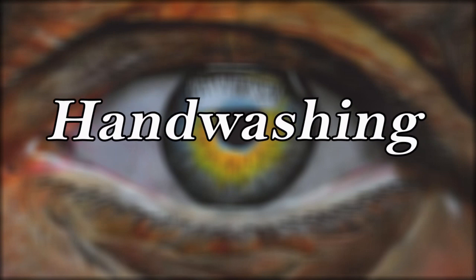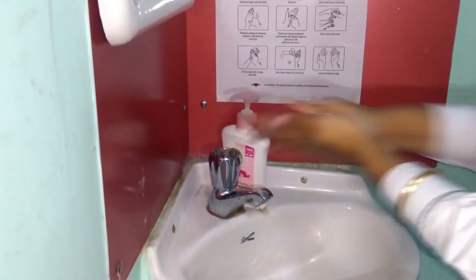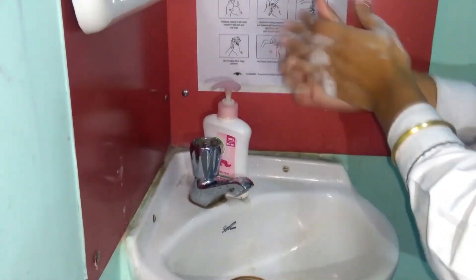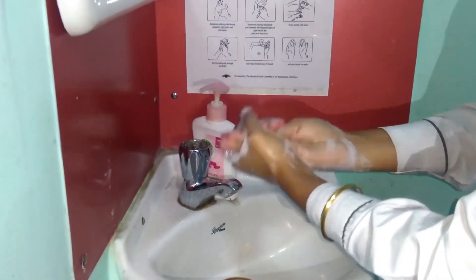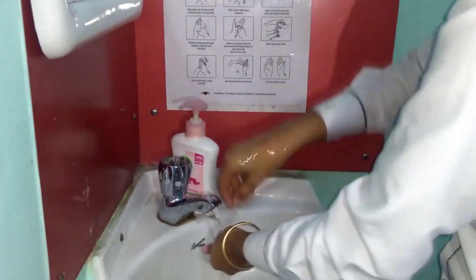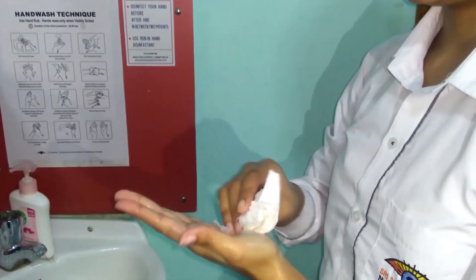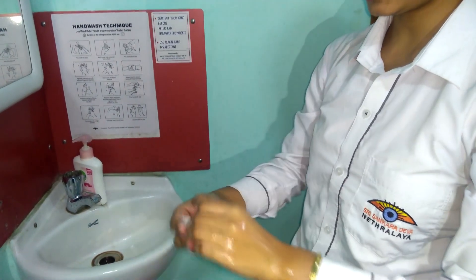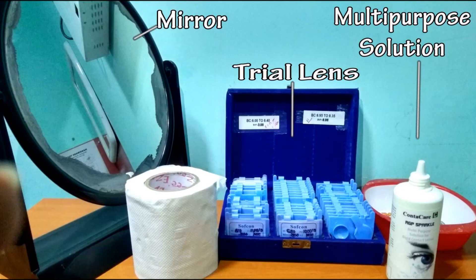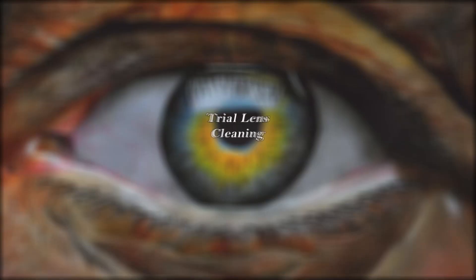Before any contact lens trial and fitting, we must wash our hands properly using the proper hand washing technique. After washing, we must dry our hands with a paper towel or air dry them — it is better not to use any cloth towel as it may contain pathogens. For the contact lens trial we would require mainly the RGP trial set, RGP lens solution, a washing bowl, a mirror, and tissue paper.